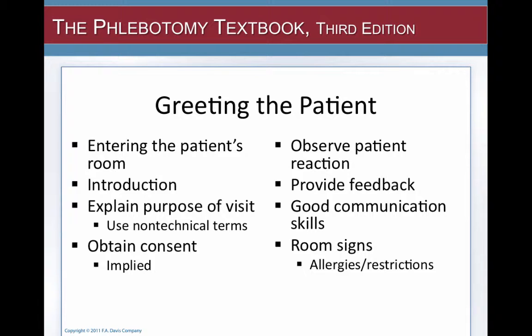You want to obtain consent. It's usually implied when you're in a hospital. You can say, is that okay, or let's get started. If they vehemently refuse, if they don't want to give blood, you do not force them. You just smile and say, okay, I'm going to go talk to your nurse about that. And you go to the nurse's station and talk to the nurse and see what they suggest that you do.